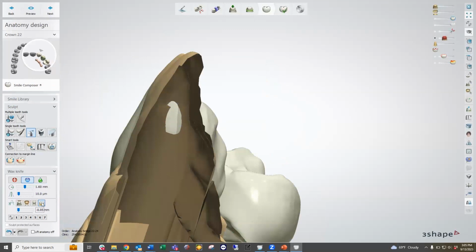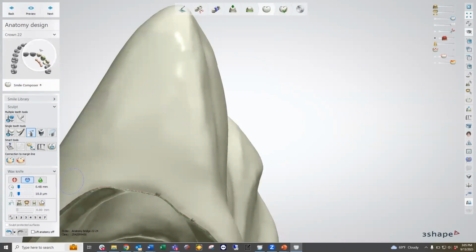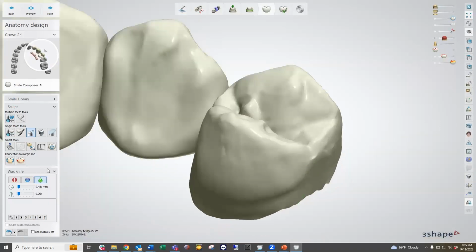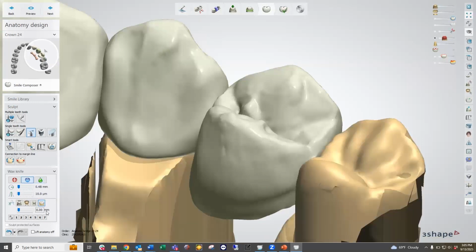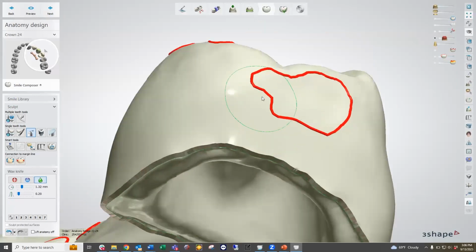And if I turn that feature off, just take a look and you can see a nice contact area in here. I'm just going to smooth up around those edges so it's not as sharp around the edge. I'm going to do the same thing with this tooth. So I'm going to click on it once, go over to my minus, and turn on that negative teeth undercuts tool to develop a nice contact area. And wherever it's a little bit too heavy, I'm going to just remove this feature. So here I have a nice contact. I can turn on my contacts if I want to see it. And now I'm going to turn off the neighboring teeth contacts so I can smooth just along that red line to ensure that we're not going to have a sharp contact area.